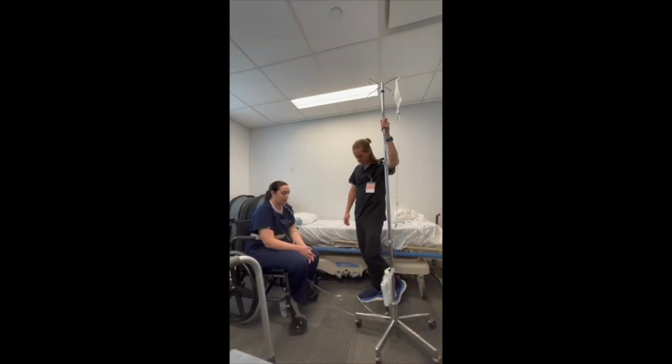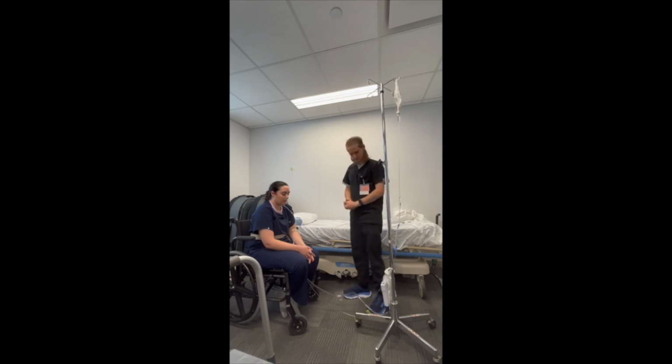Good. Okay, so the next thing we want to do, now that we're in the chair, is work on some ambulation with this patient. So to add some things that we want to teach you with assistive devices and some techniques that we've learned, we're going to use a rolling walker for ambulation for this case.